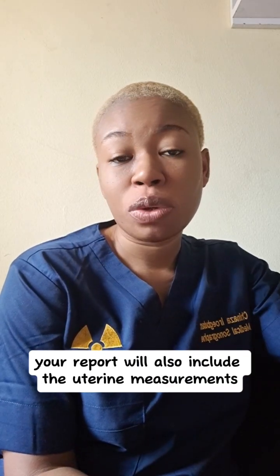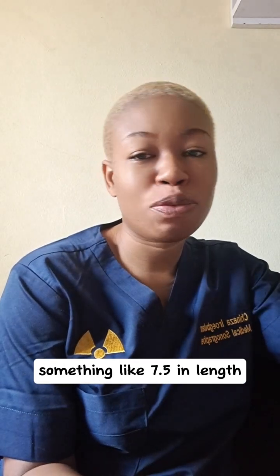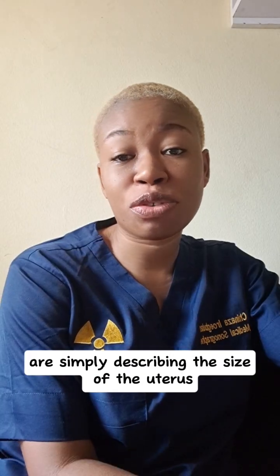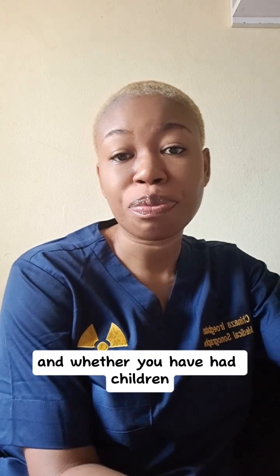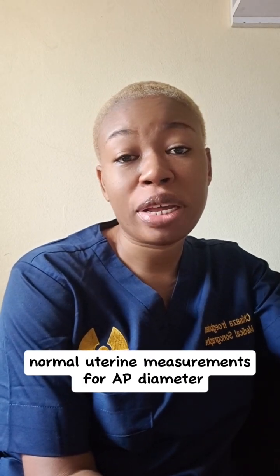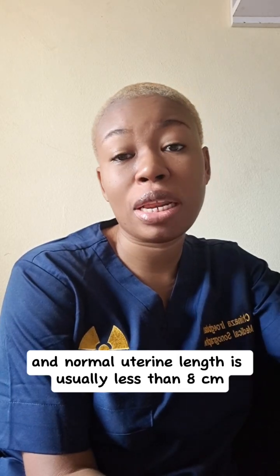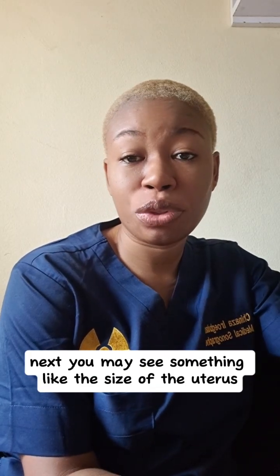pregnant. Your report will also include the uterine measurements, something like 7.5 in length, 4.2 centimeter in AP diameter. These numbers are simply describing the size of the uterus, and they are compared to what is normal for your age and whether you have had children. Normal uterine measurements for AP diameter is between 3 to 5 centimeter, and normal uterine length is usually less than 8 centimeter.